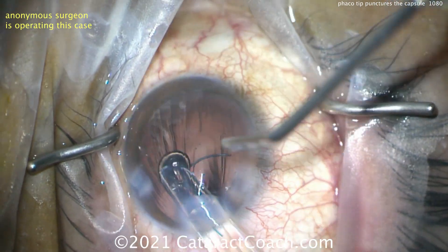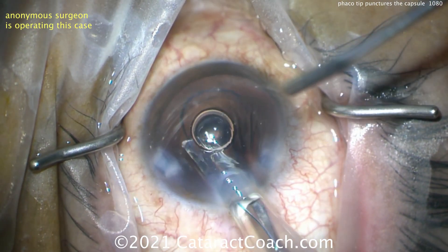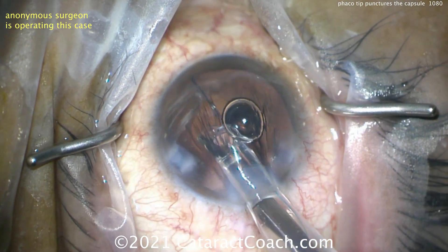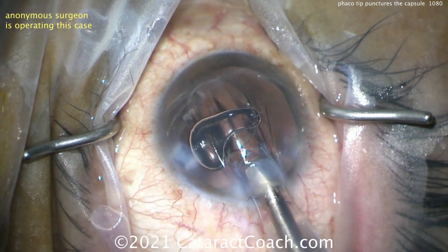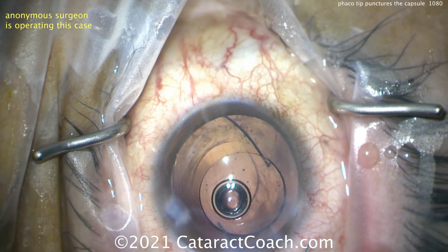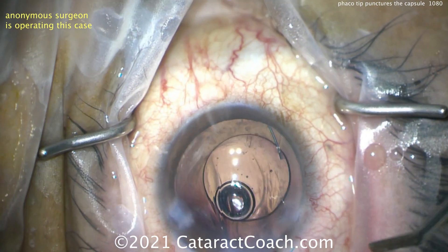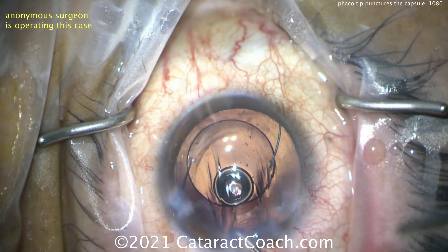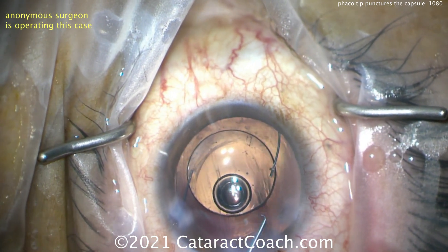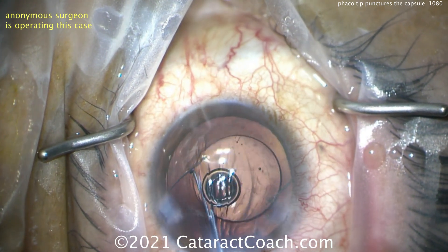Here comes the lens — whoa, wrong direction! Remember the 7L rule: that first haptic better look like a number seven. That is not a number seven. That's better, but the trauma of getting this thing flipped over — you have to know how to deliver a three-piece lens. There are so many good videos explaining this; please watch them.